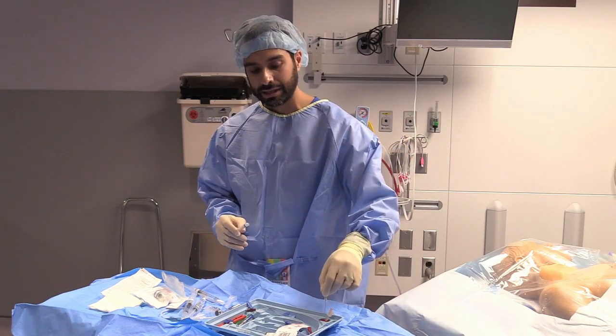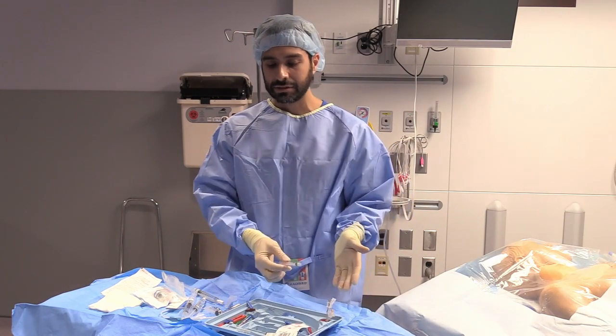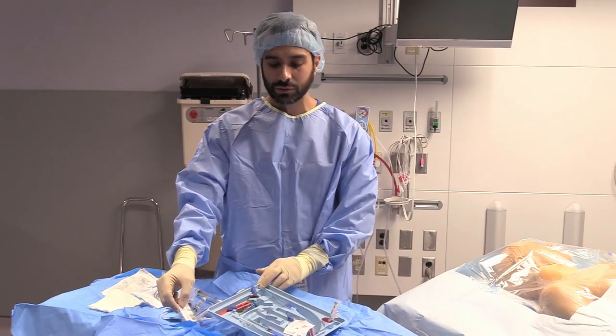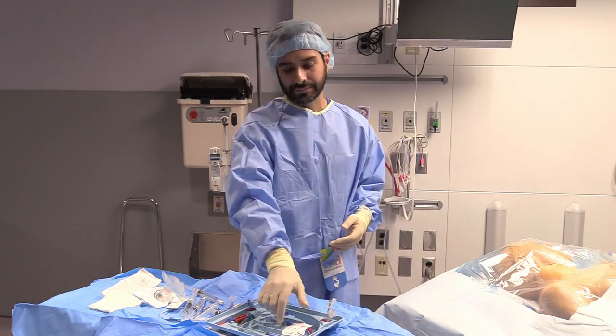Once that's done, I'll place my needles into my needle holder here. And I like to do that afterwards. I don't like leaving the needles open on the kit. I don't know who's going to be in there helping with us, or if I should need something and somebody has to put a sterile gown on, and then there's open needles there. So I always place them in there when I'm done.